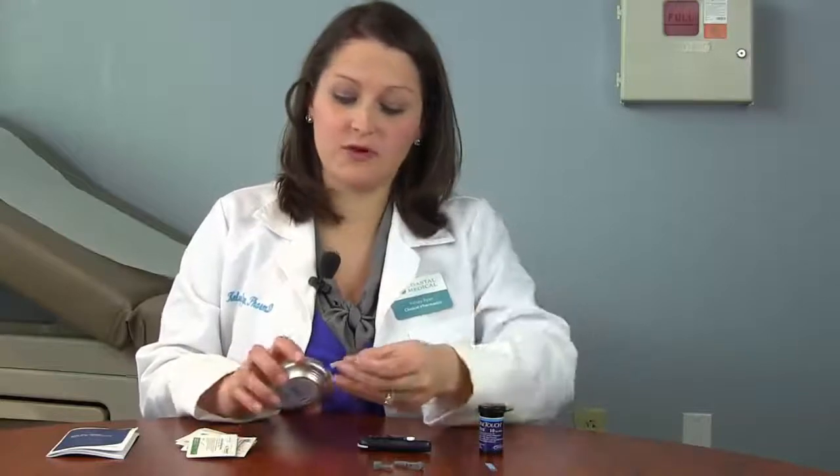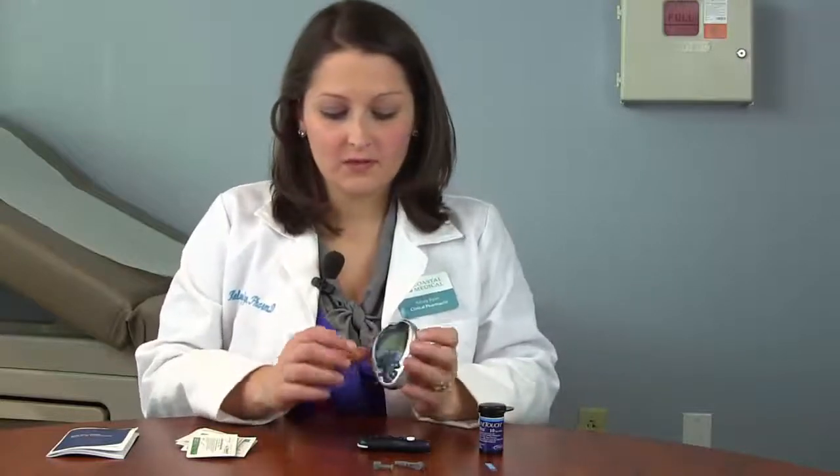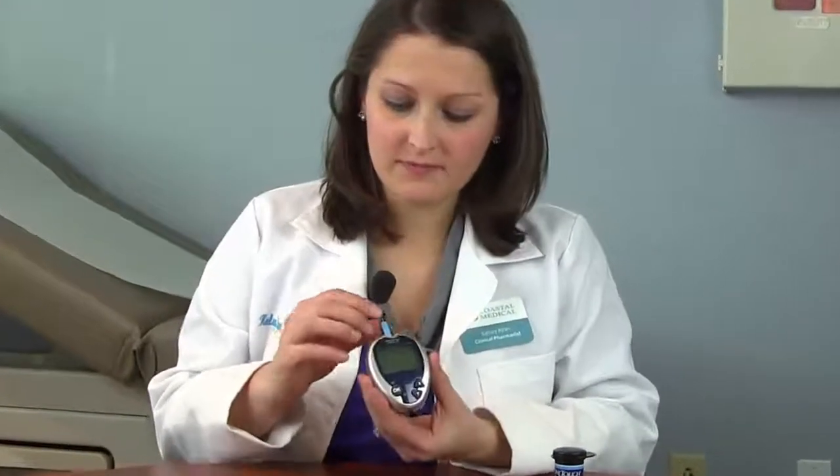The next step is to get our glucometer ready to go. We do this by inserting a test strip into our glucometer. When we do so with this meter, you will see a number flash across the screen. This number is used for coding purposes and should match the number also on your test strip vial.